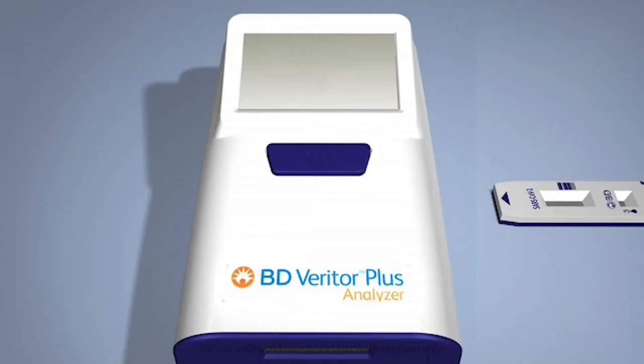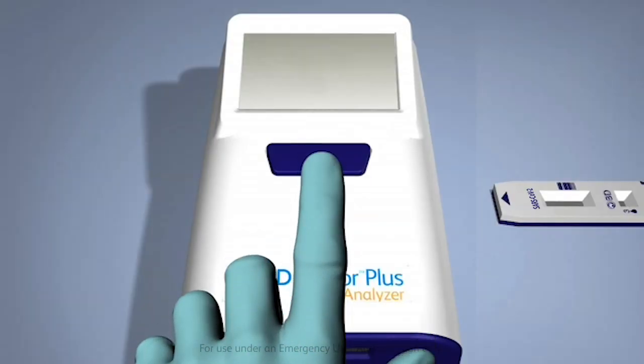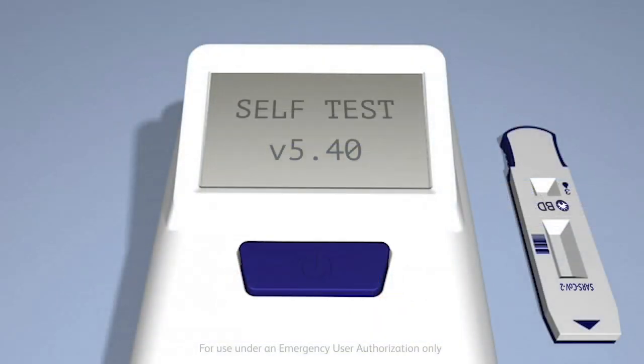For operation in walk-away mode, power on the BD Veritor Plus analyzer. Immediately after powering on, the analyzer will perform a self-check to verify its operation.